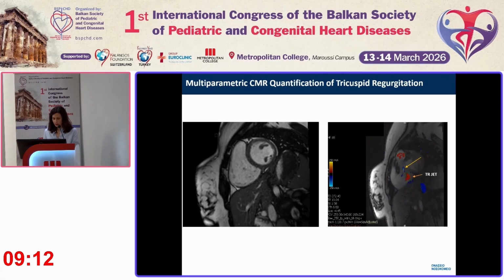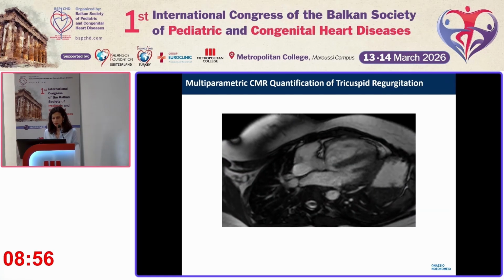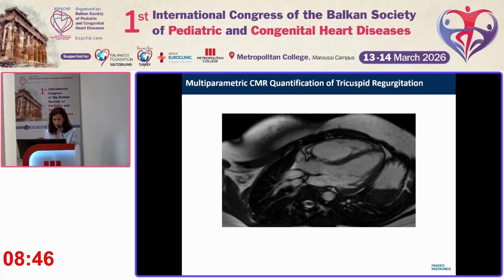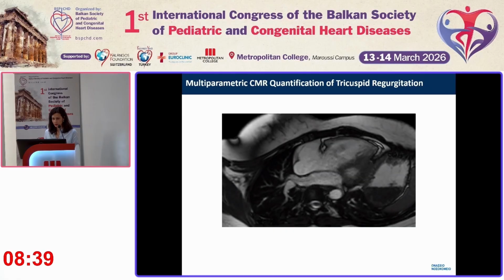You simultaneously see a blue jet that represents an additional flow in systole that comes from the left ventricle to the right. It is essentially a ventricular septal defect, which is a small perimembranous VSD, partially occluded by tricuspid valve tissue, and it is seen here in the three-chamber LVOT view. You can see the involvement of the septal leaflet with redundant tissue into the VSD.